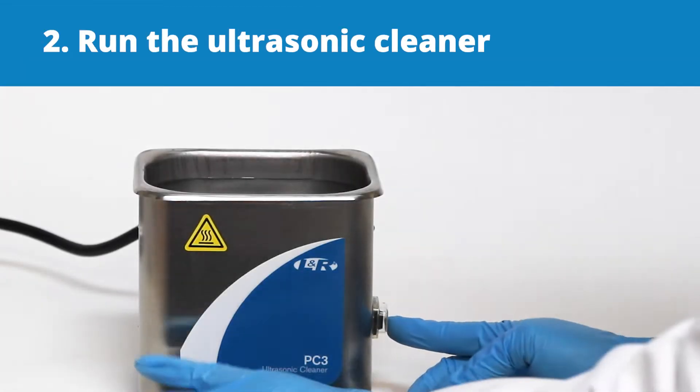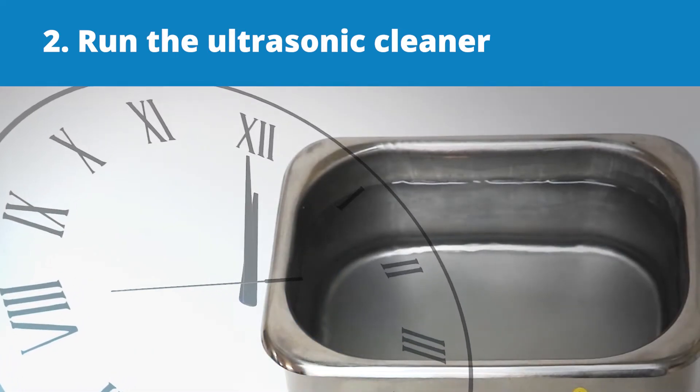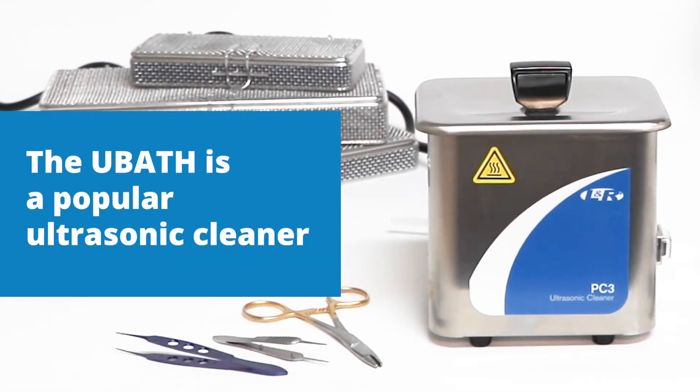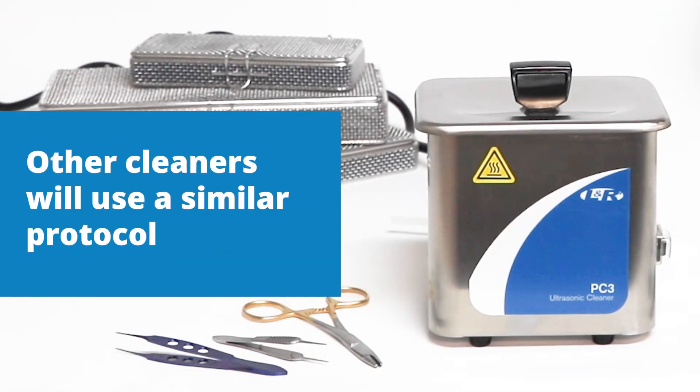Next, run the ultrasonic cleaner for several minutes to degas the solution and to reach the correct temperature. The U-Bath is a popular ultrasonic cleaner, but other cleaners will use a similar protocol.